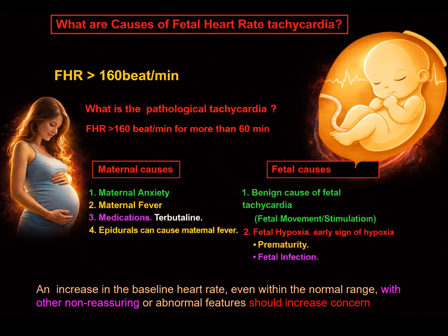Increase in the heart rate could be due to maternal causes or fetal causes. Maternal causes like anxiety, fever, medications, or epidural analgesia. Whereas fetal causes include benign causes like fetal movement stimulation, and fetal hypoxia, an early sign of hypoxia, as well as prematurity and fetal infection. An increase in the baseline heart rate, even within the normal range, with other non-reassuring or abnormal features should increase the concern.